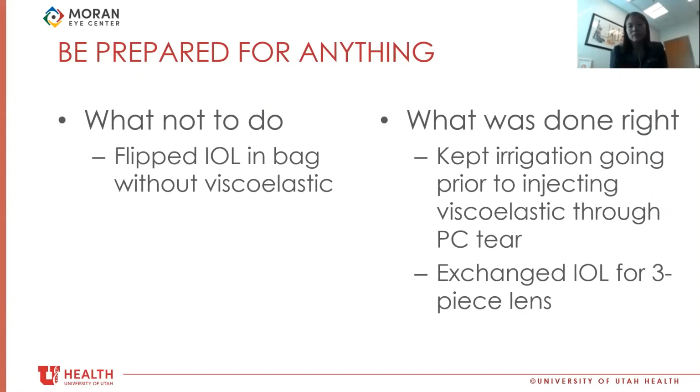I've had a similar situation happen, but one thing I was wondering about, and curious to see what your thoughts were, is what are the optics of leaving the lens flipped upside down in the bag? I think the refractive error might be a -0.5, but I'm not positive. Okay. I guess it depends on each lens. I've never left an IOL upside down, and I just didn't want to deal with the consequences of that.